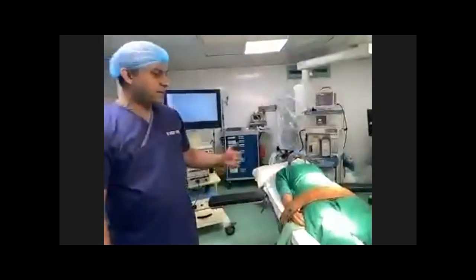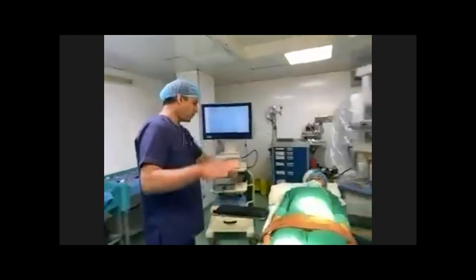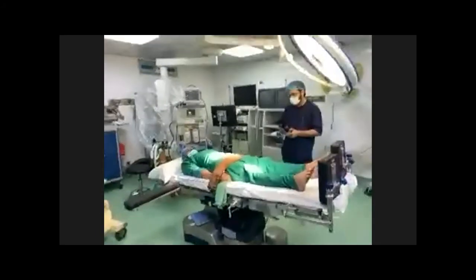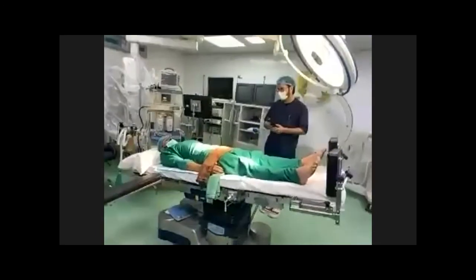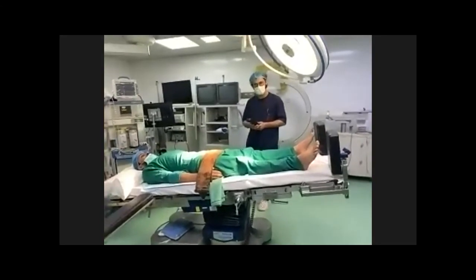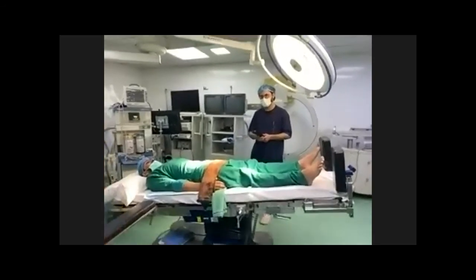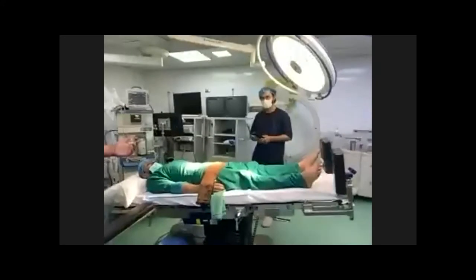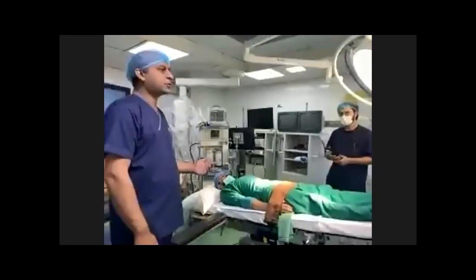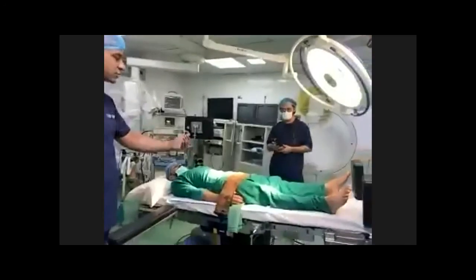What we do is lie the patient in the position called the Trendelenburg position. Here you can see a panoramic view. You can tilt the patient 15 to 30, even 35 degrees in this Trendelenburg position. This position is usually used in laparoscopic appendicectomy or laparoscopic gynecological procedures, where you work more in the pelvis, so you want the viscera to go back.